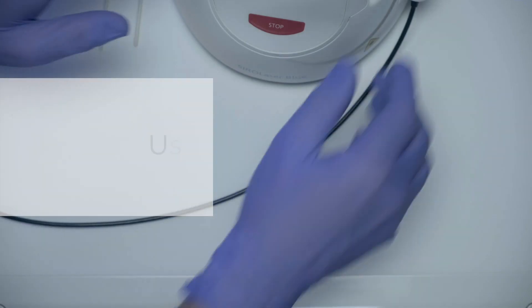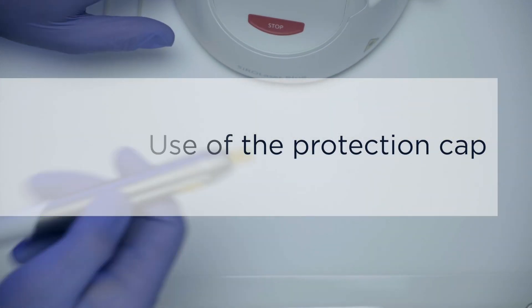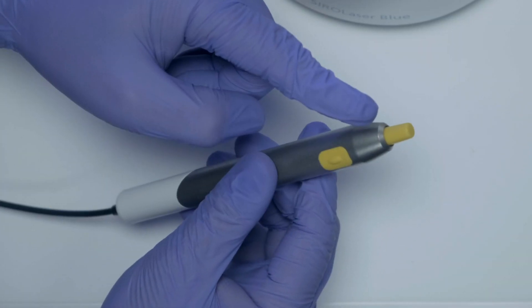Whenever the Serolaser Blue is not being used, make sure to keep the protection cap attached to the handpiece.